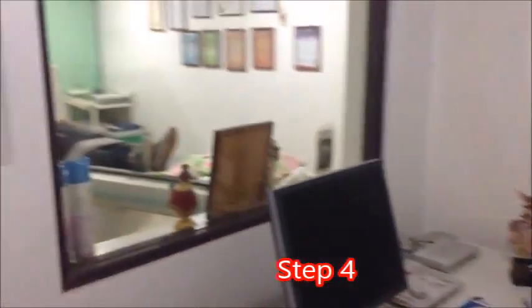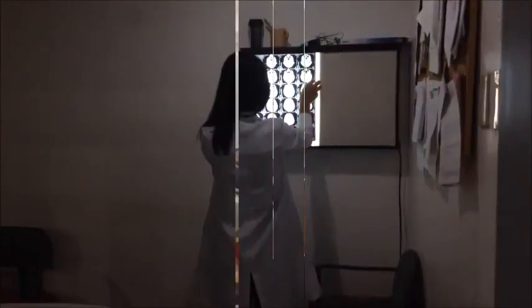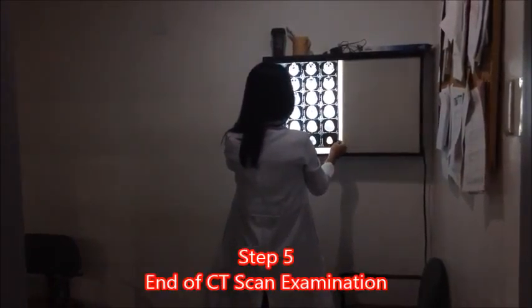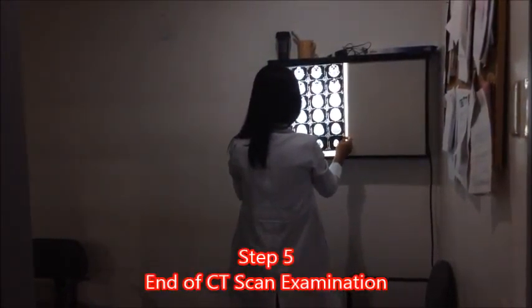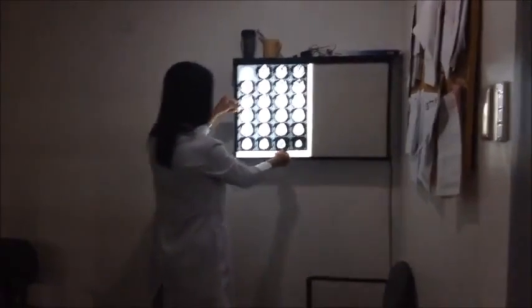The technologist directly watches the patient through an observation window during the procedure, and there is an intercom system in the room for added patient safety. After the procedure, your examination will be read and interpreted by one of our board-certified radiologists who specializes in CT.